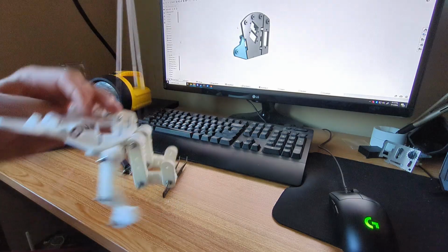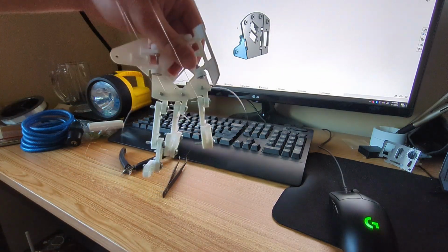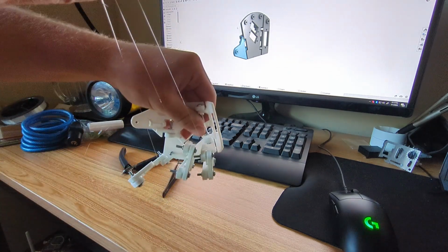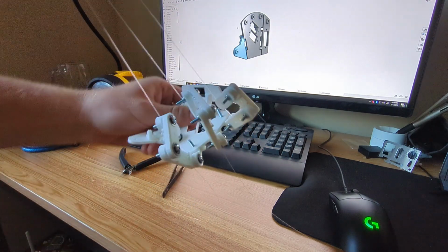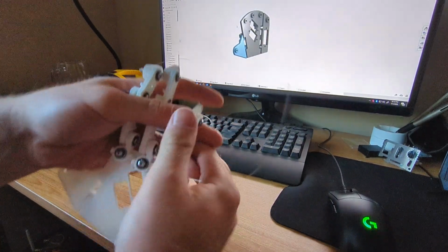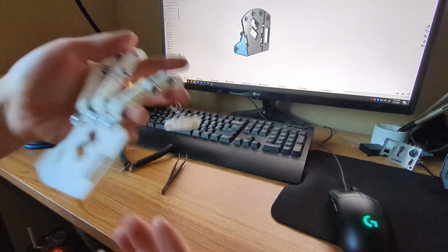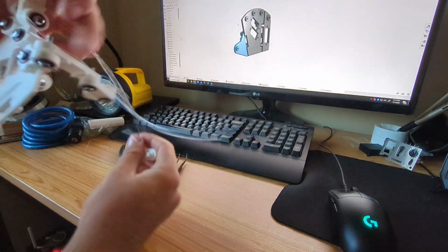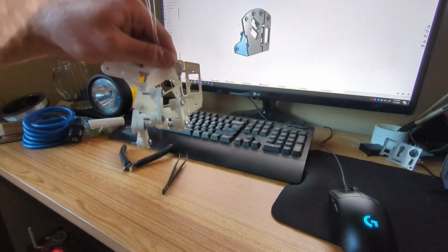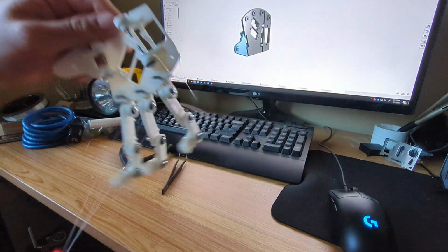Because it's hard to actually get a grip on fishing line, I got all the tendons wired into a handle here. So I can go ahead and pull it, and it clenches. It's very floppy because a lot of the stuff, like the finger's side to side motion, is unconstrained. So pulling this guy, there's just no control over it. But I mean, that works. Pretty happy with that.